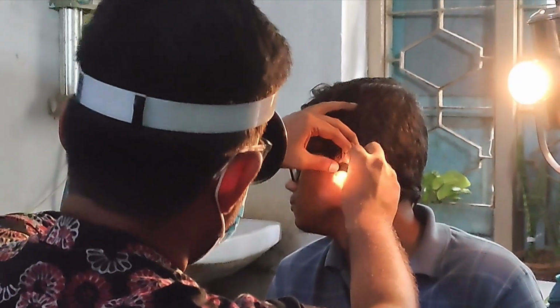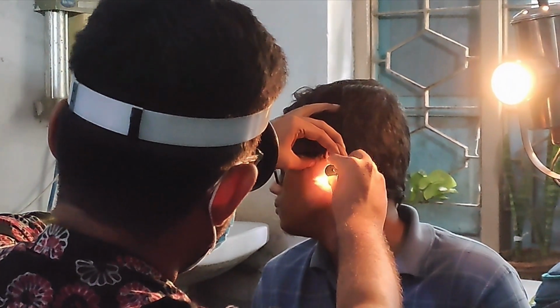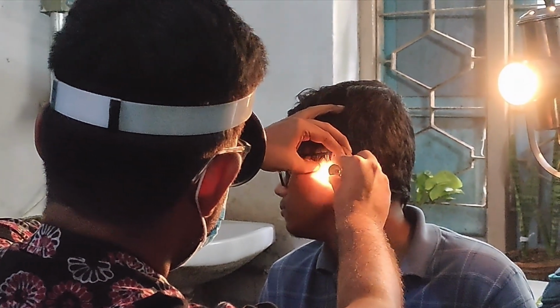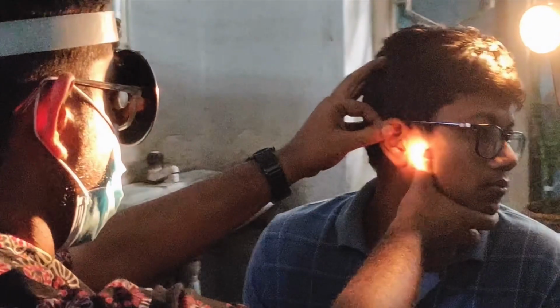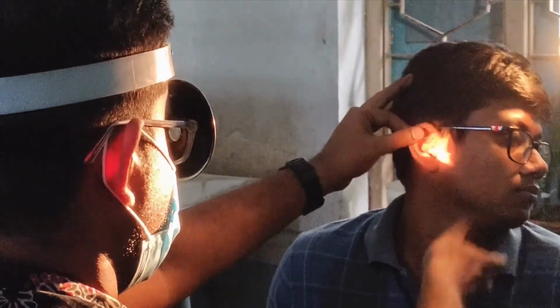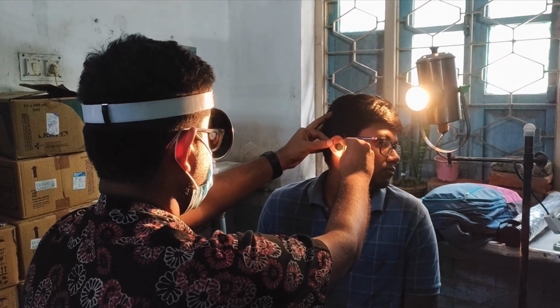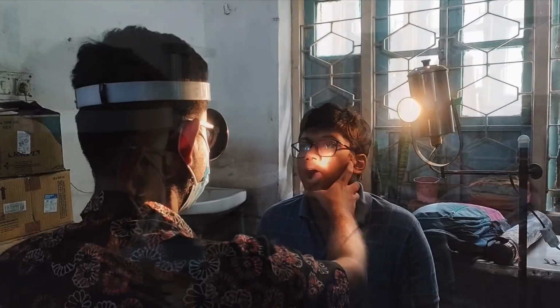Now to examine the ear with a speculum, it will be absolutely similar. The pinna has been pulled upwards, backwards and laterally, and the speculum has been introduced. That will give you a better view of the external auditory canal as well as the tympanic membrane. I'll repeat the same thing on the right side. I have turned the patient's head to the left and pulled the pinna upwards, backwards and laterally. Now I'll introduce the speculum, and that is how you examine the external auditory canal and the tympanic membrane.